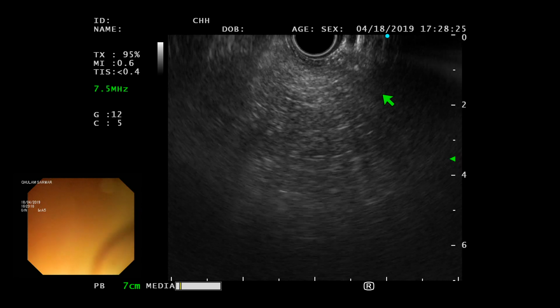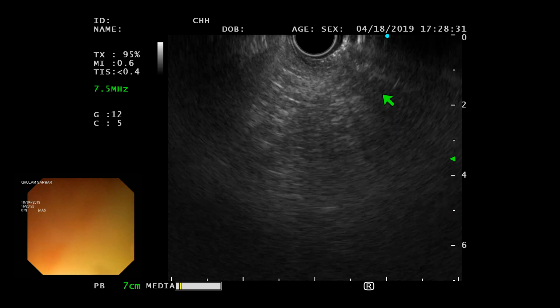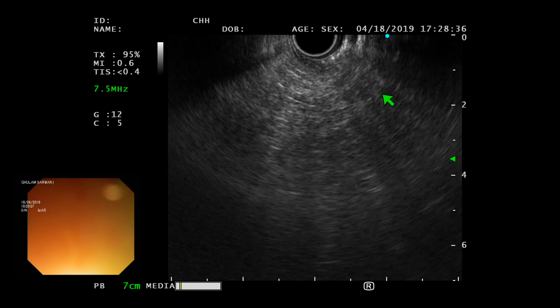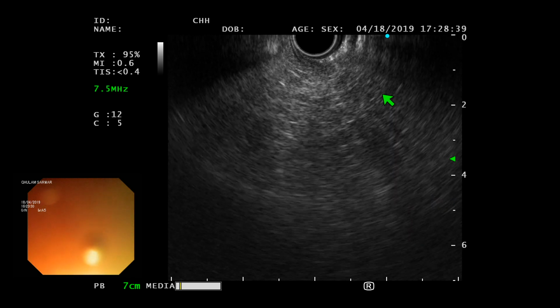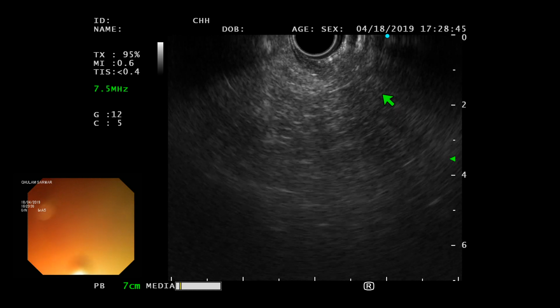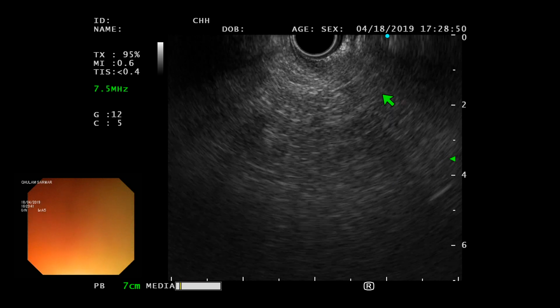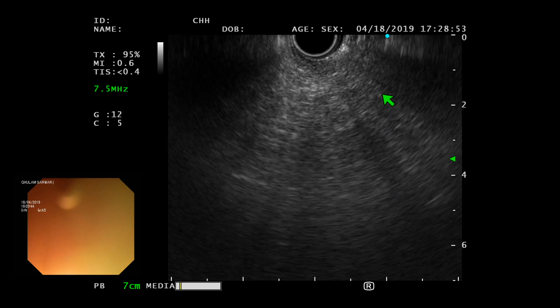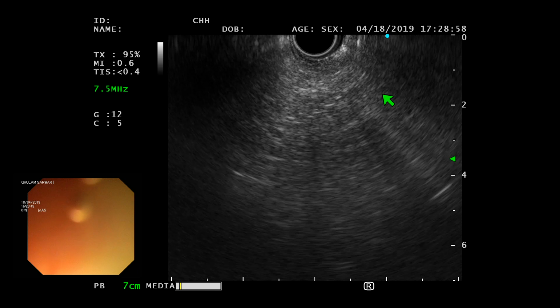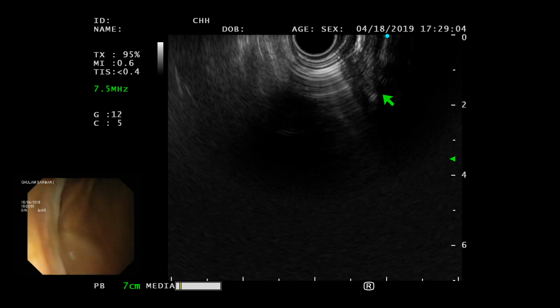Either the tissue or whatever that organized sludge is which I'm seeing in the gallbladder, the first pass I made of that, there are cells on there, and they don't look right. They have big nuclei, and they are very, very concerning. I've made like 4 or 5 passes from the neck of the gallbladder. Out of those, the first pass and 2 other passes have some cells which are very concerning. So one pass from the body of the gallbladder or close to the fundus, and 2 passes from the neck area, are showing some cells in there.